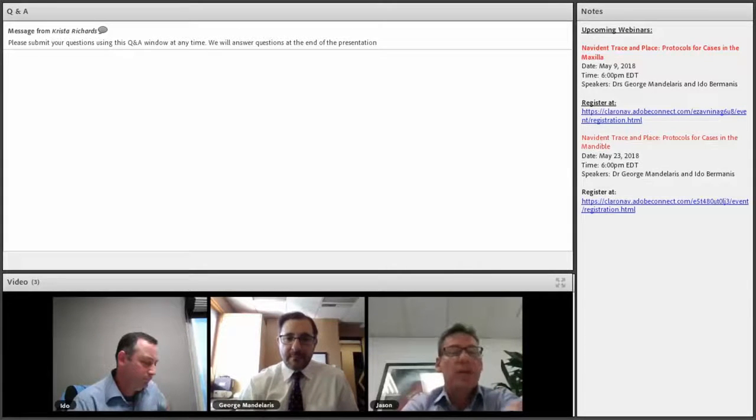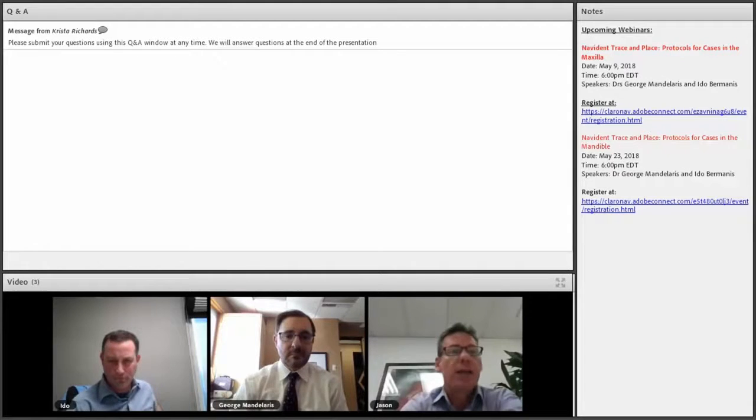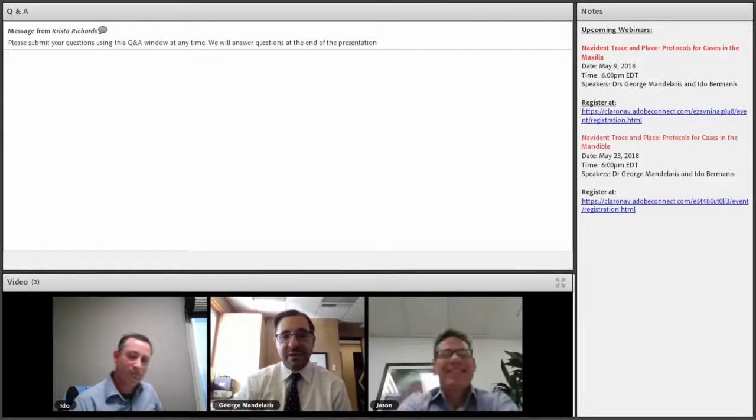Or again, as you mentioned, it's very mindful not to hit the head tracker or move the jaw tracker, which is very stable. But if you were to bump the head tracker or move the jaw tracker in some way, it's another 2-minute trace, and you're back in business. In most cases where I've had a problem, I'm the problem, not the system. I'm the problem, but that's okay. I'm open to suggestions, and I'm correctable.